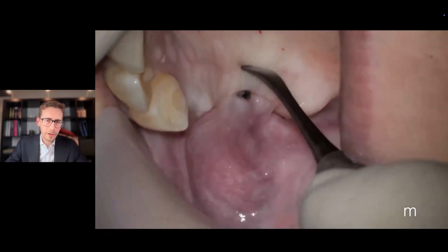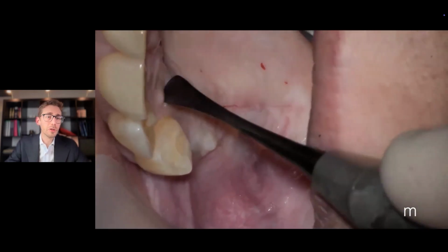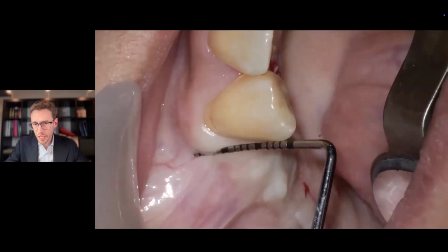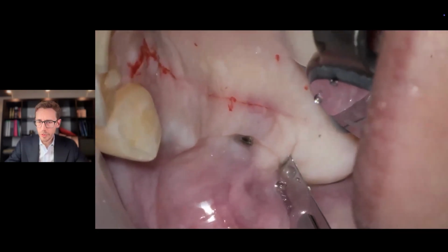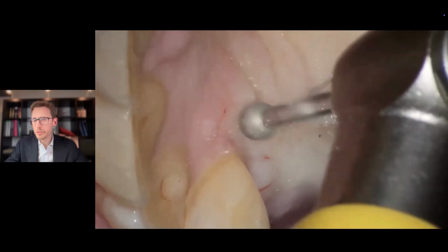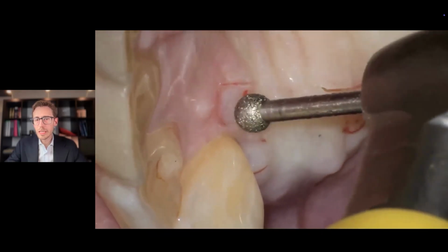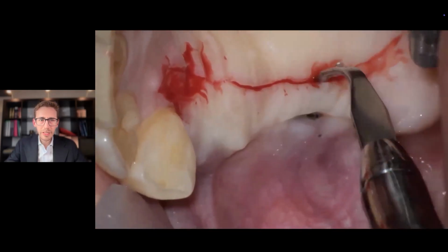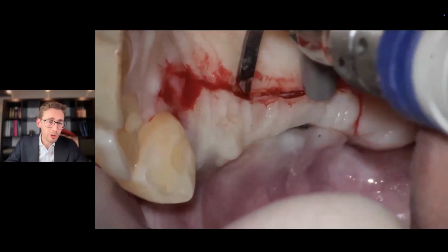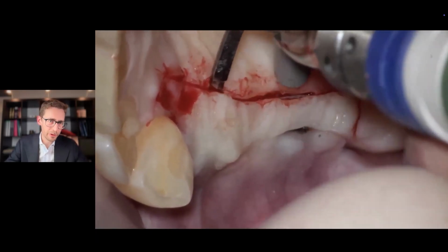And 4 months afterwards, you see the reopening phase, where we basically have to provide the patient with an apically repositioned flap in order to gain vestibule depth. So this is a very conventional vestibuloplasty technique with a small modification in which we create a very small pouch at the mesial aspect of the palatal flap, which we deepithelialize and which we're going to use as a connective tissue graft for augmenting the phenotype on the buccal aspect of tooth number 13.